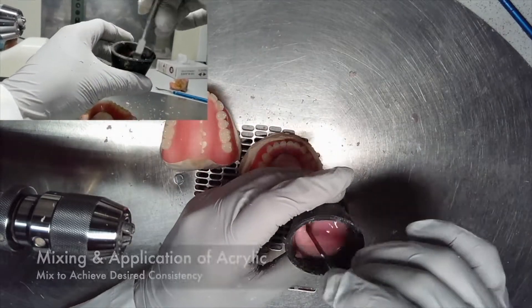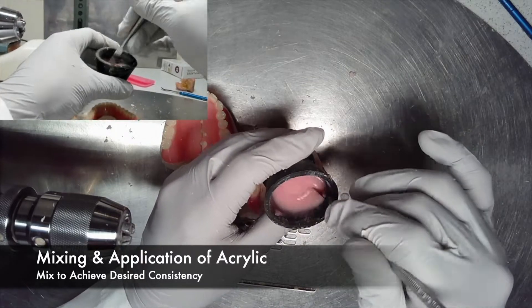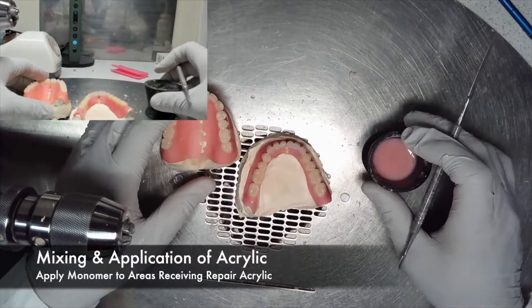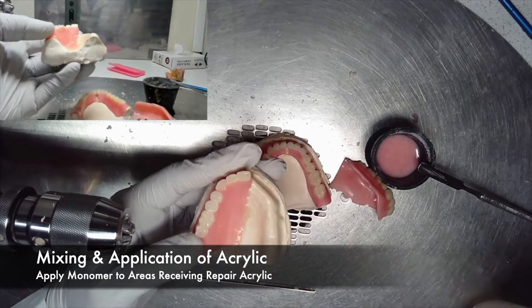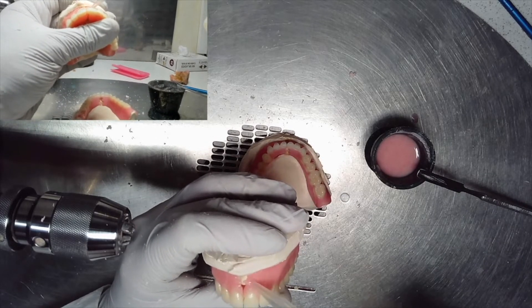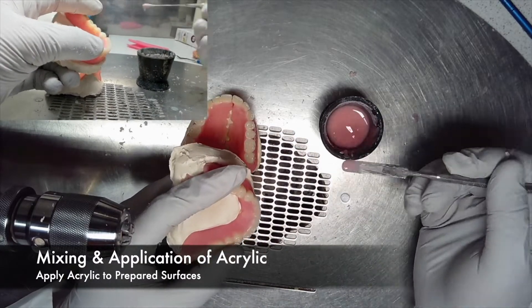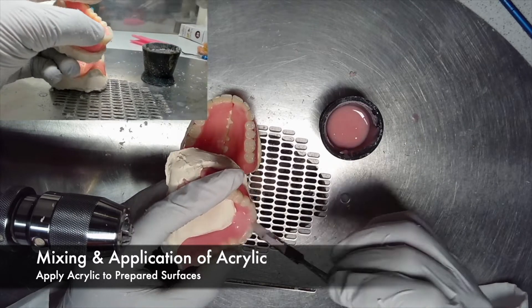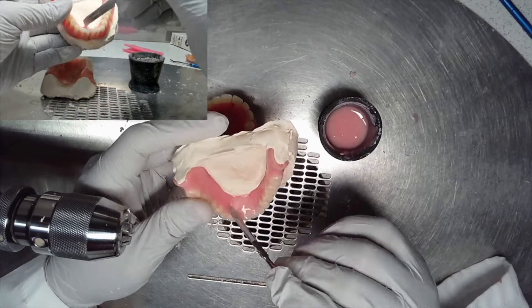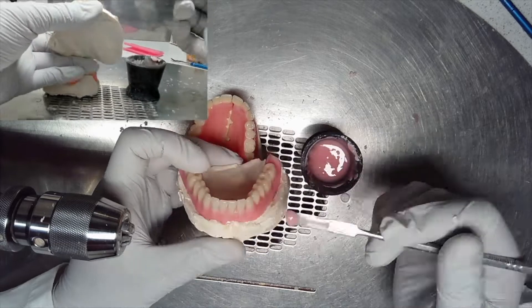Once all the pieces of the fracture are completely prepared, it is now time to begin mixing and applying the acrylic. Initially, you want to mix your acrylic to achieve the desired consistency. Apply monomer to areas that are going to be receiving the new acrylic — this is important to prevent demarcation lines, which are lines that occur between new and old acrylics. Apply the acrylic to the prepared surfaces. Consistency is key: if the acrylic is too liquidy it will run all inside the intaglio of the denture; if the acrylic is too thick it will be unable to reach the intaglio. Be sure that the consistency meets the requirements of the task.